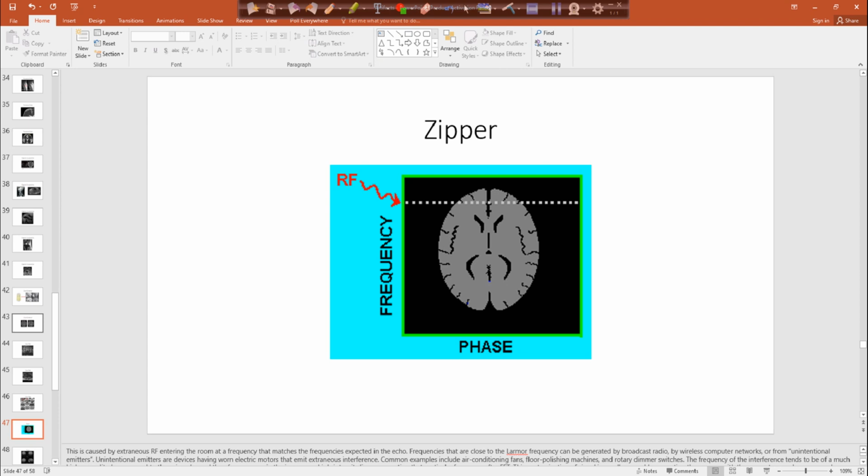And that's why MRI doors are so hard to get open, because they line the doors with those copper teeth so that the random RF energy doesn't get into our room. It could be even from a light bulb that is blown out, and it's just the little fuse of the light bulb, the wiring of the light bulb, that comes from that.